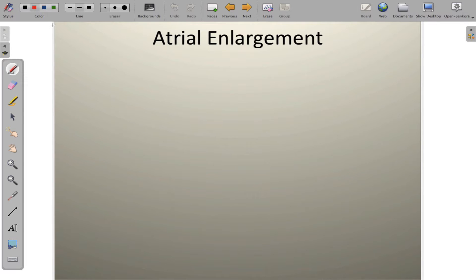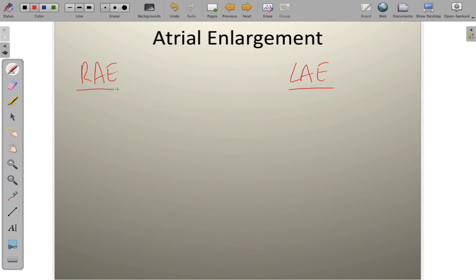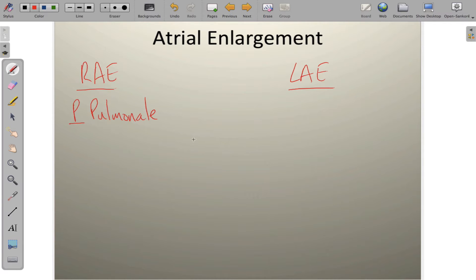Atrial enlargement — we have two atria, so we can look at right atrial enlargement and left atrial enlargement, each with its respective set of rules for interpretation. Let's look first at right atrial enlargement, also known as P-pulmonale. This is typically a pulmonary problem that causes P-wave changes. P-pulmonale is a P-wave whose amplitude exceeds 2.5 millimeters of elevation.